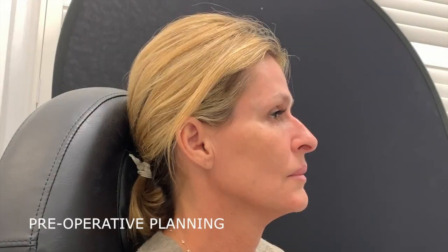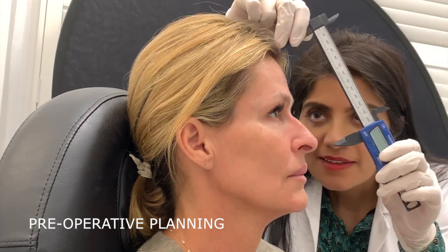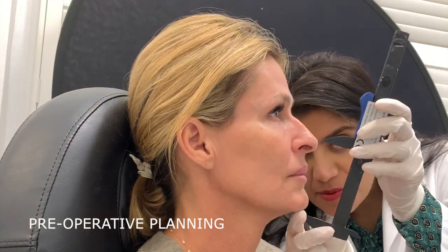When evaluating a patient for non-surgical rhinoplasty, it's essential to appropriately analyze the nose in advance of the procedure. This includes assessment and caliper measurement of the nasofrontal angle, radix projection, supratip break, nasolabial angle, previous scars, asymmetry, presence or absence of a dorsal hump, symmetry and straightness of the dorsal nasal aesthetic lines, tip projection, alar notching or retraction, and importantly, the presence or absence of prior surgical rhinoplasties.